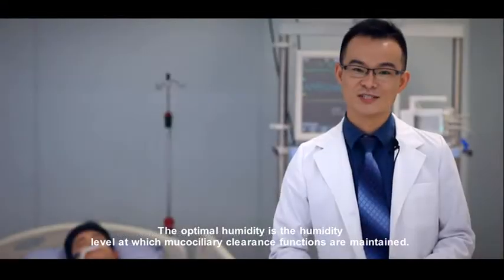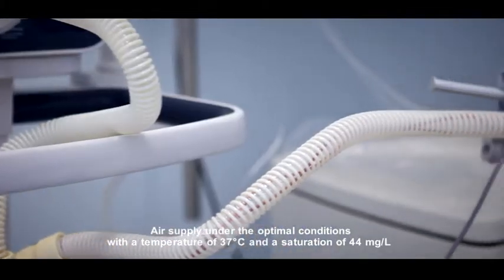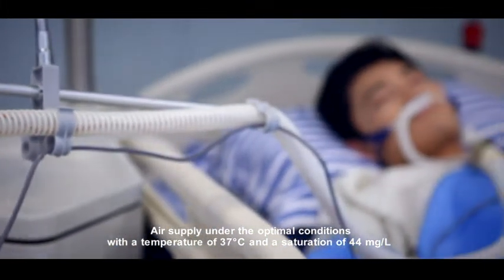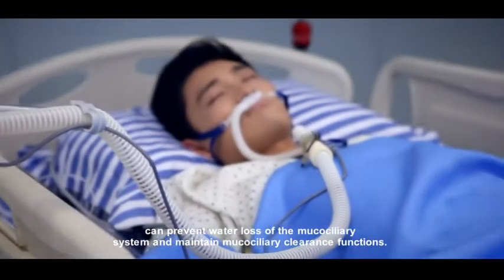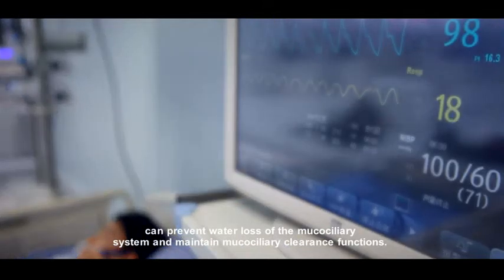The optimal humidity is the humidity level at which mucociliary clearance functions are maintained. Air supply under the optimal conditions, with a temperature of 37 degrees Celsius and a saturation of 44 milligrams per liter, can prevent water loss of the mucociliary system and maintain mucociliary clearance functions.